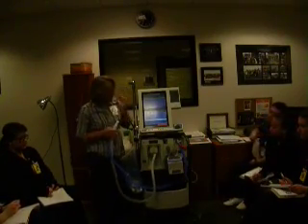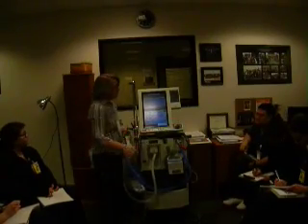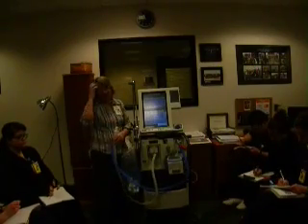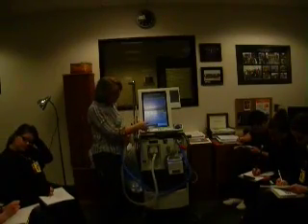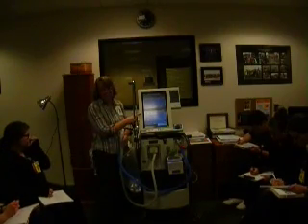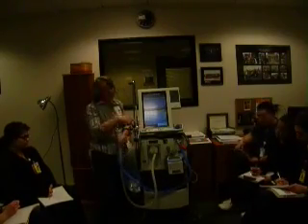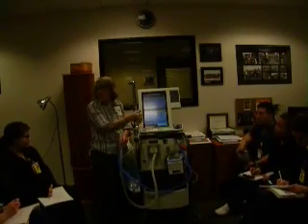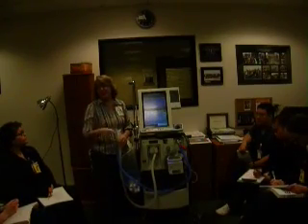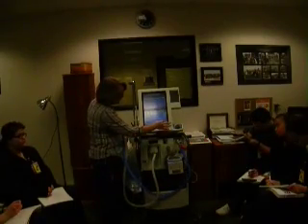Okay, now it says unblock Y. When done, press accept. And I'm reading everything right from that orange screen, so that's what you guys will need to follow. SST testing completed. Normally, we wouldn't have to override. I have to override because we don't have oxygen. But normally, once this was done, you would say exit SST and it would restart on its own. If I exit SST now, because it hasn't passed, it's going to loop me right back into another SST. And it won't let me do anything. So we're just going to override it for now.